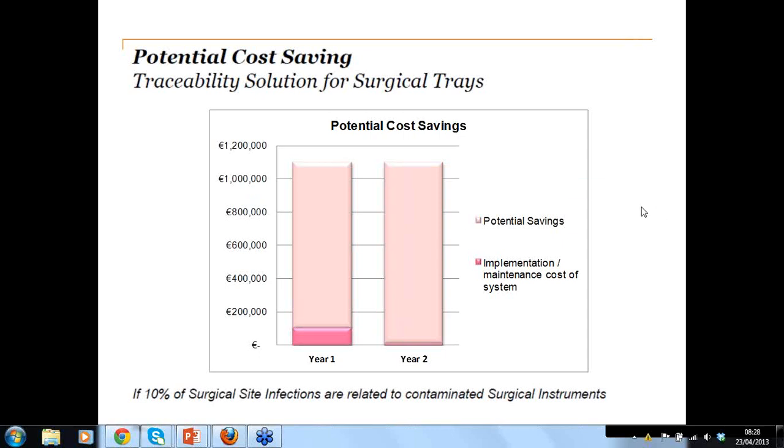Part of the process is to look at the checklists and ensure that all the items are there in the tray. One benefit of the system is that once that checklist is done once, it's up there in the server. So when the tray is scanned in at the smaller hospital, a checklist is printed automatically showing exactly what should be in this tray, so someone will be there checking to ensure that all items are in the tray.